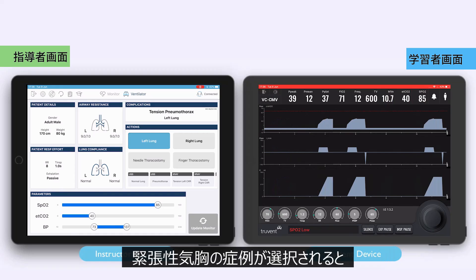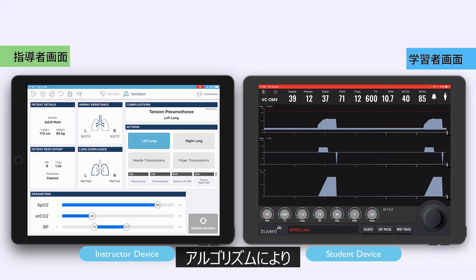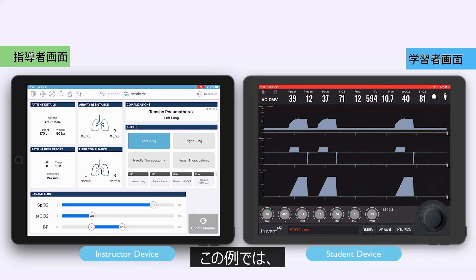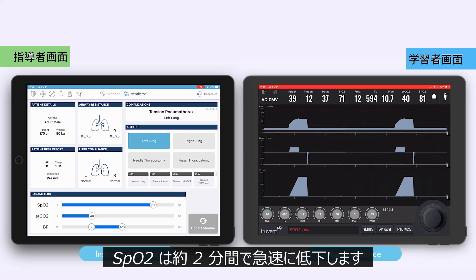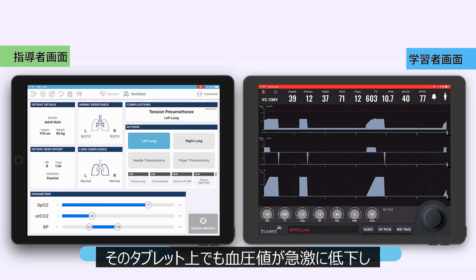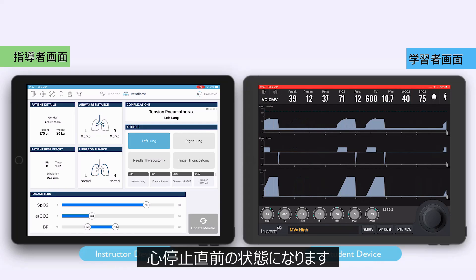Once the tension pneumothorax complication is activated, the algorithm will also lead to immediate changes in SpO2 and blood pressure. In this example, the SpO2 will rapidly fall over the course of approximately two minutes. If there is a third iPad in the system, the measured blood pressure will also rapidly fall to a peri-arrest situation.